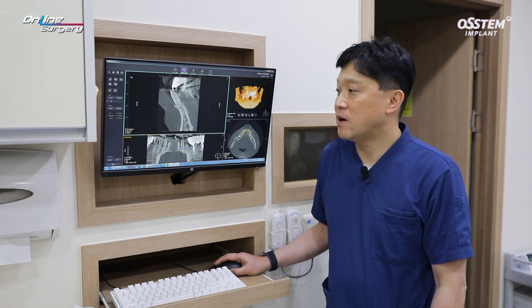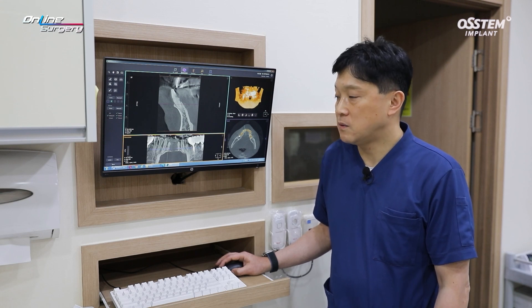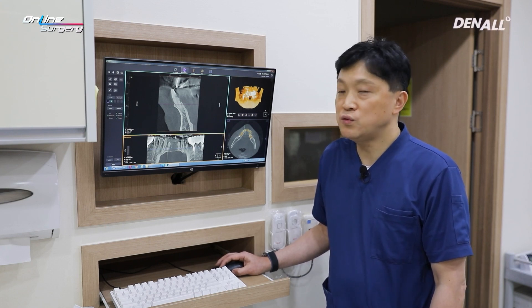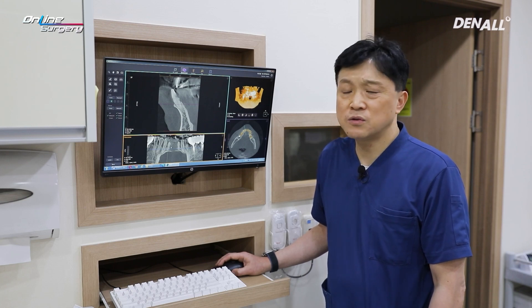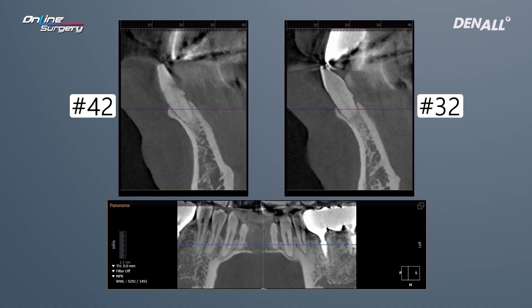There is mobility in number 32, but the patient does not feel significant discomfort. If you look at number 42, there is a bit of alveolar bone left, but if I were to place implants in numbers 41 and 32, another surgery may be required if a problem occurs in relation to number 42. In this case, numbers 32 and 42 are going to be extracted and implants will be placed in numbers 32 and 42.